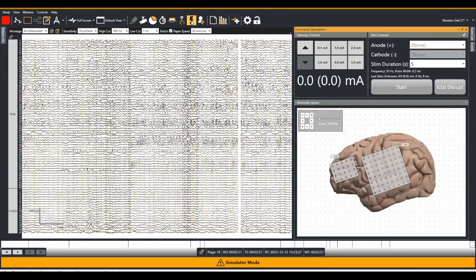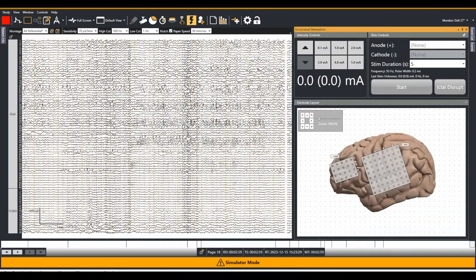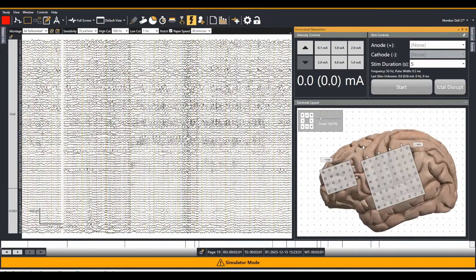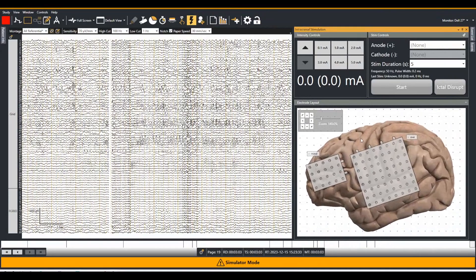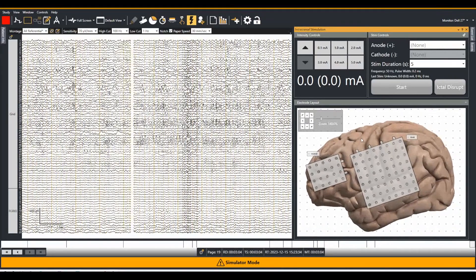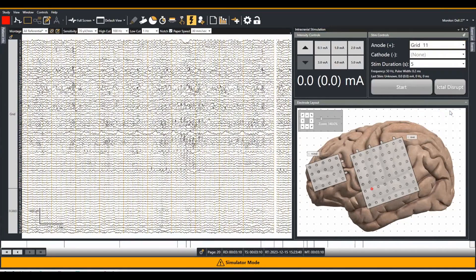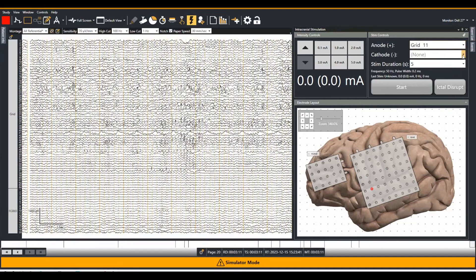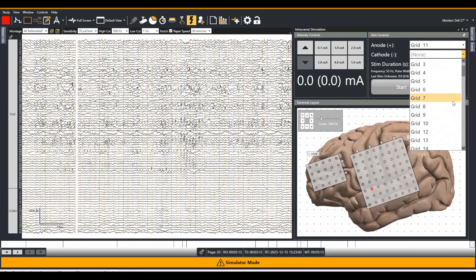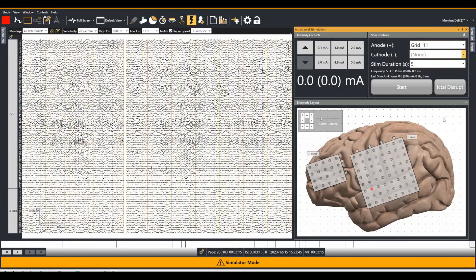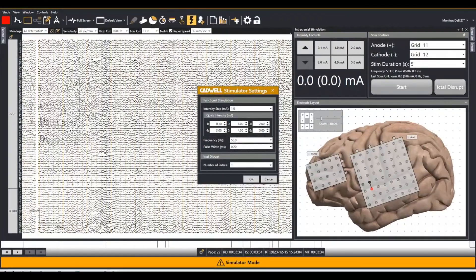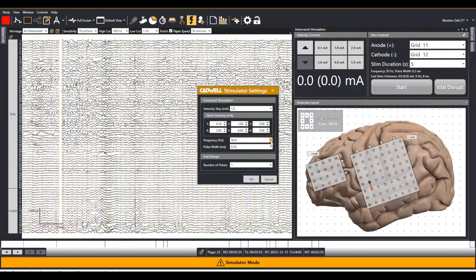Cortical stimulation parameters are programmed entirely in the software. For functional brain mapping, use the internal switch matrix for stimulation of any contact across amplifiers. There is no need to unplug and re-plug electrodes, as the Cascade Iomax hardware is fully integrated with the ARC Zenith amplifier for software-driven anode and cathode selection and stimulation.